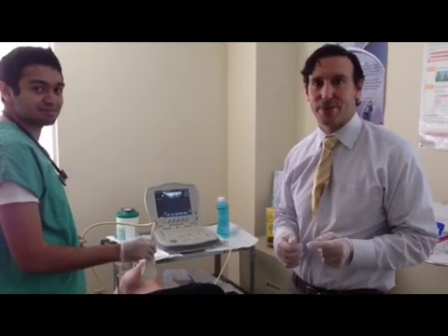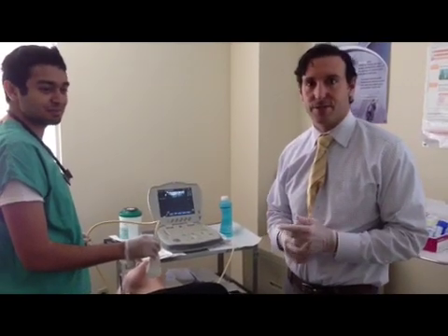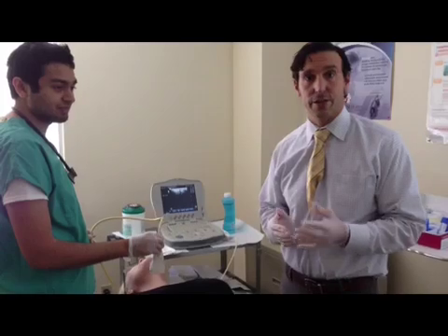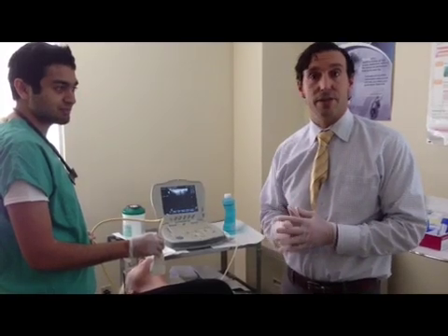Good afternoon. Today we're performing an ultrasound guided fine needle aspiration of a thyroid nodule. We have all of our equipment set. This is for the people out there that have any questions or issues and are concerned about what their physician has advised them to do.